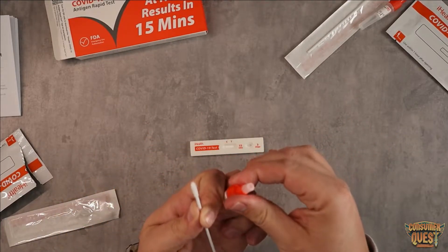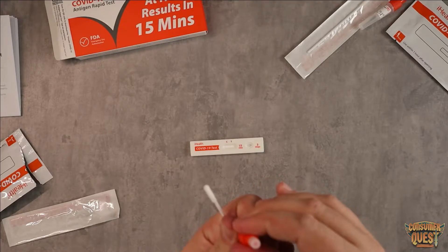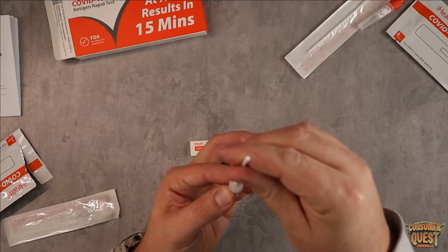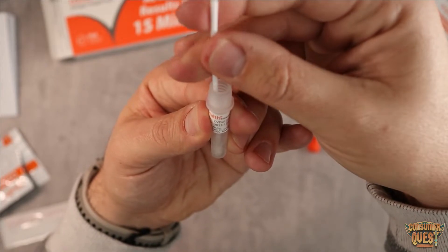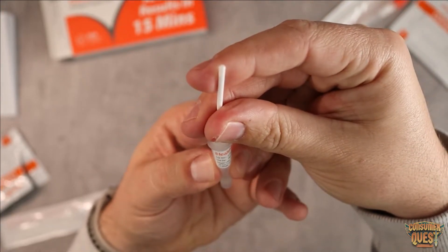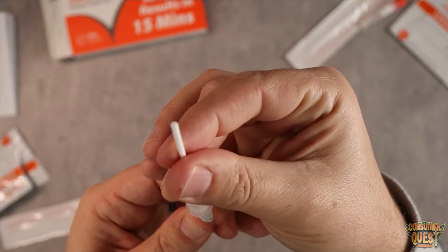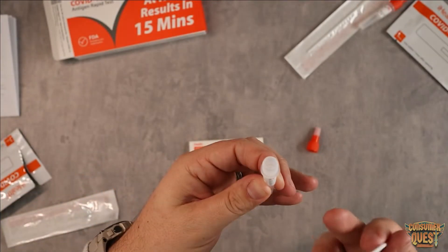Now what I'm going to do is take off this orange cap — this is the larger of the two caps. You want to make sure that you keep the swab away from anything, don't let it touch anything. Now you're going to put the swab down inside the fluid and stir it around a good amount, getting it fully submerged, really let it soak a little bit. The sides of this container are squishy, so you can pull the swab out a little ways and squeeze it inside there to get as much fluid out of it as you can, because you want to get a lot of the fluid from the swab into the container.